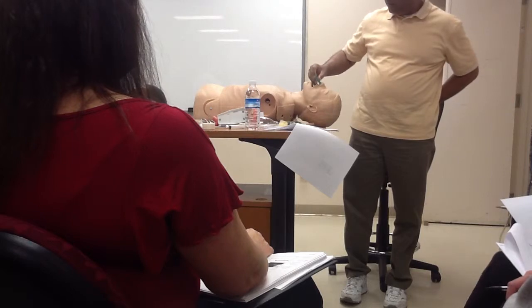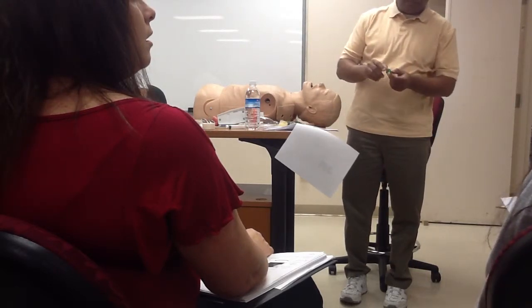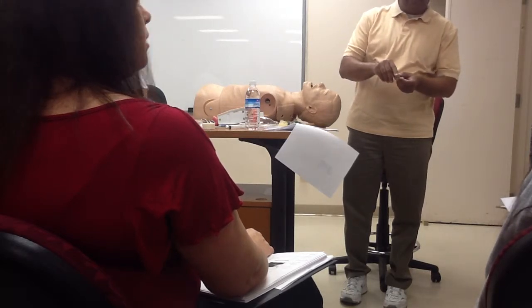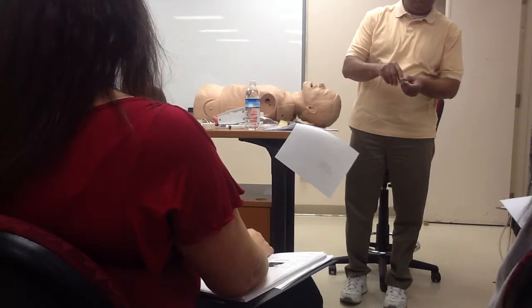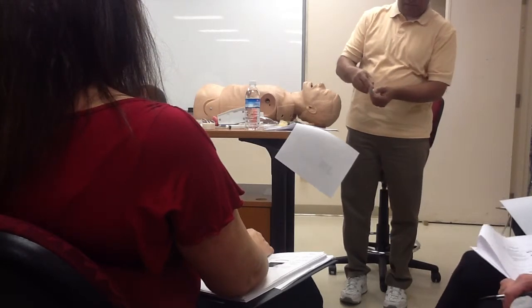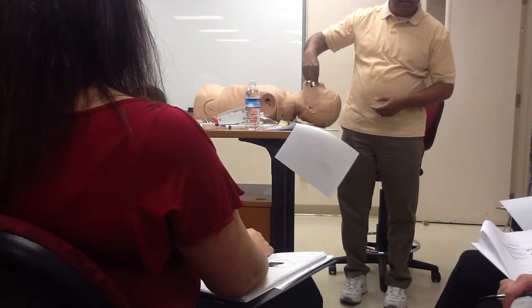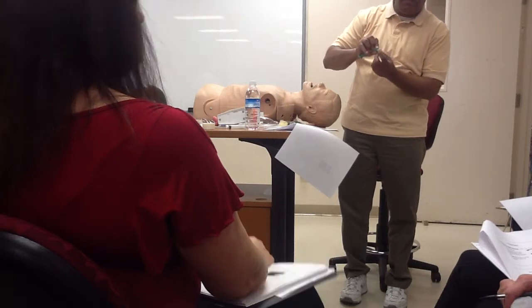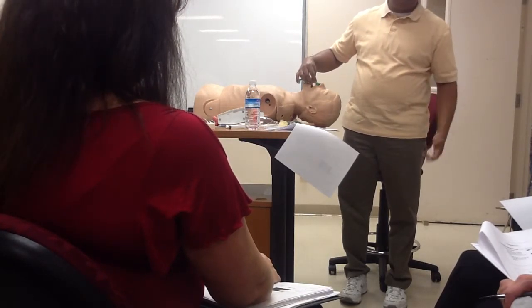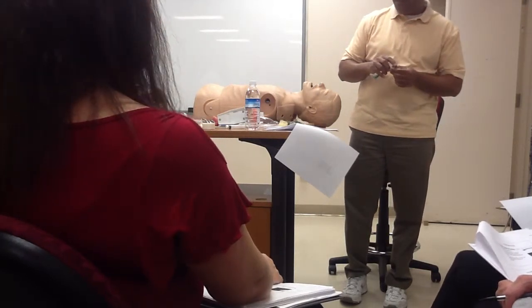Did y'all see that? They always suggest to keep the tip towards the septum, and that's the easier way to put it in. If you turn it the other way, it seems like it's just gonna gouge into the bone structure. She wants the cut piece towards the septum, but it's up to you. Somehow that will slide in easier. Instead of anatomically, probably this side. I mean, I never seen something shoved in my nose. I know, right? You would think it would bother you more if you had to rotate it though.